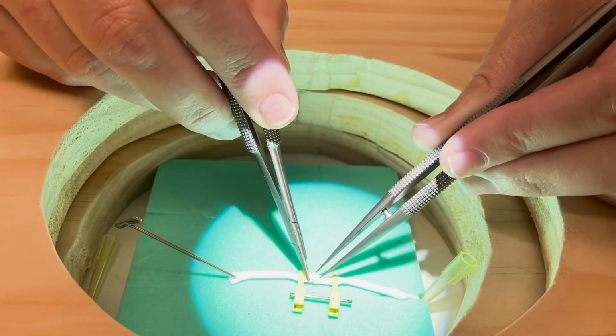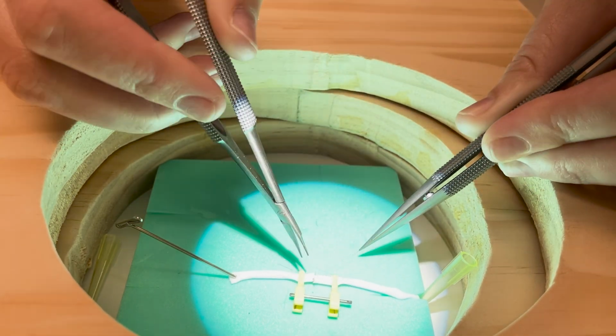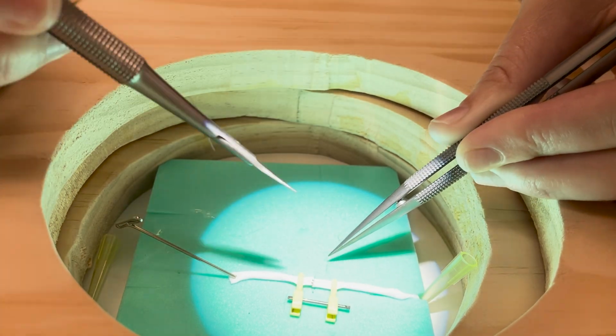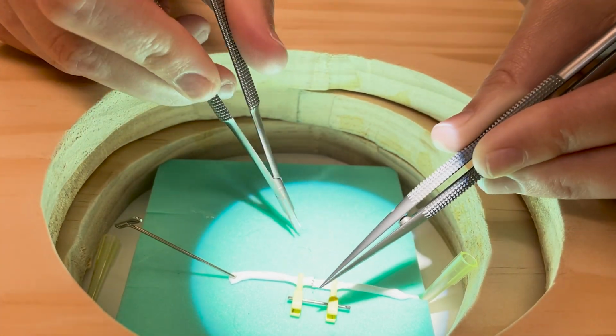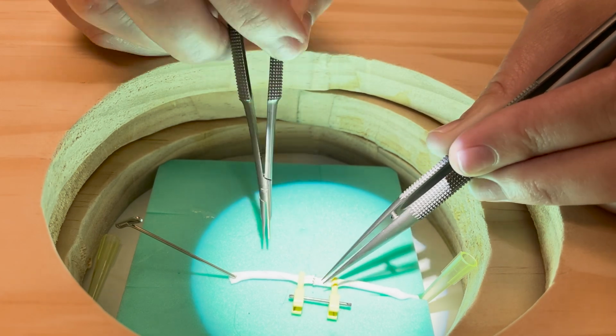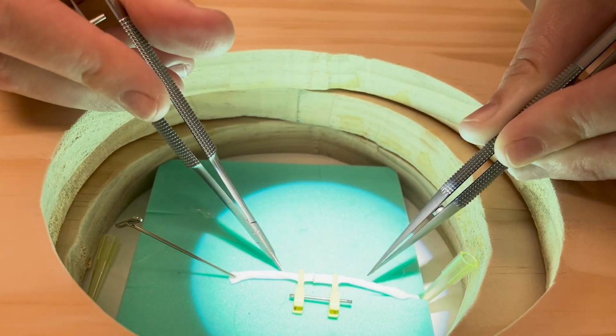Evaluation of the anastomosis should be performed with the Stanford Microsurgical and Resident Training (SMART) scale. The task should be completed in 12 minutes, and the average SMART scale score should be 4.0. Critical errors of vessel elevation, wide opening of jeweler forceps tips, and not following the curve of the needle should be avoided.